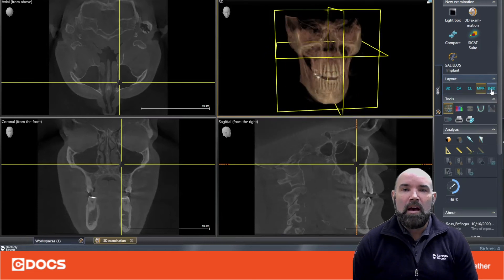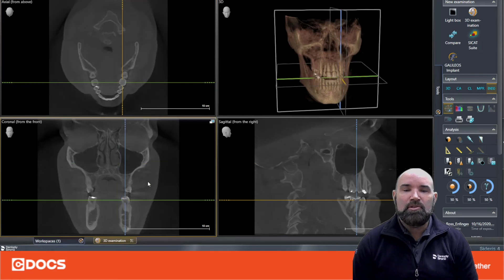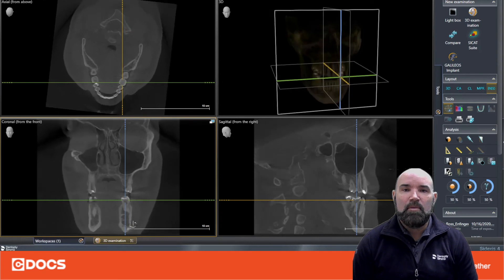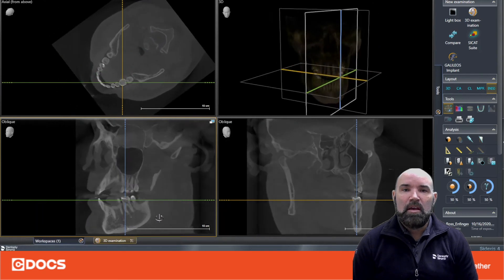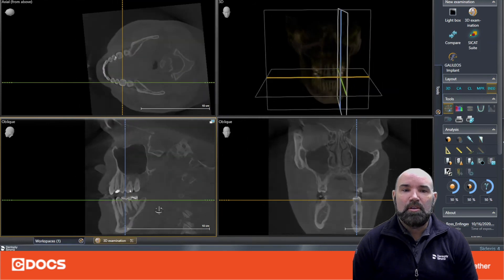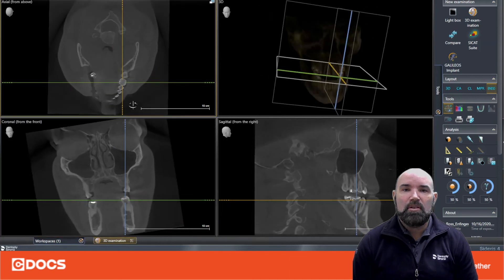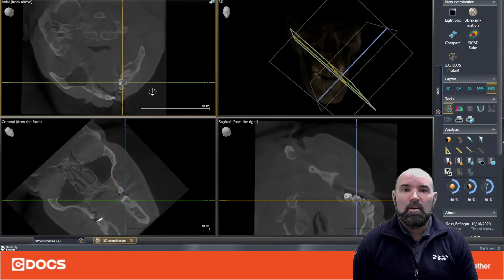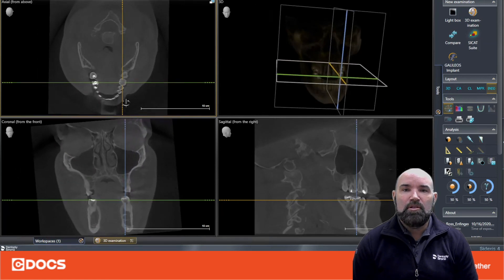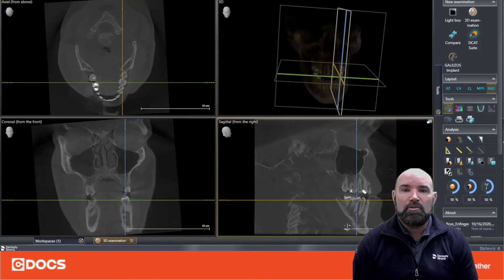Lastly we have our endo view. This is a very helpful tool in evaluating endodontic situations. If we had a periapical abscess on tooth number 30, it would be helpful to use these endo sliders and have a 360-degree view of the tooth in question. We can do this in our coronal slice, along our axial slice, or along our sagittal slice, allowing us to visualize the structures 360 degrees around the tooth in question.